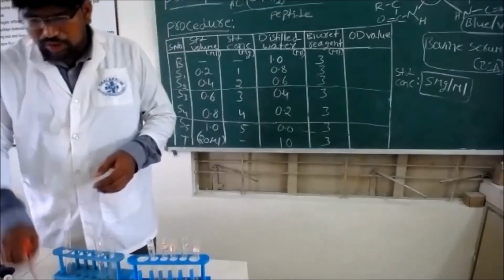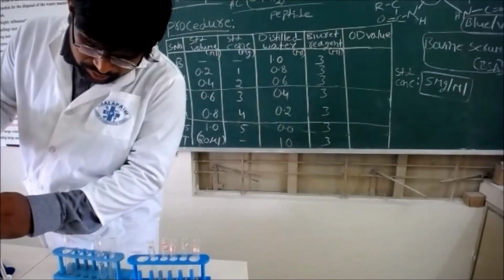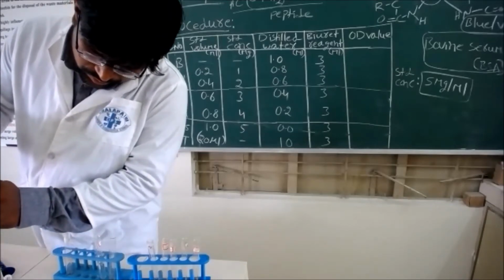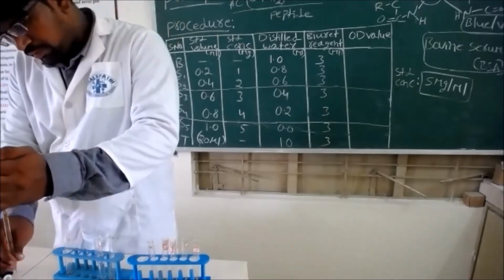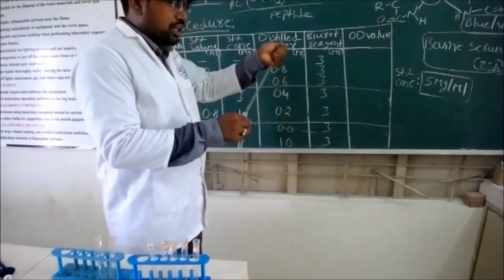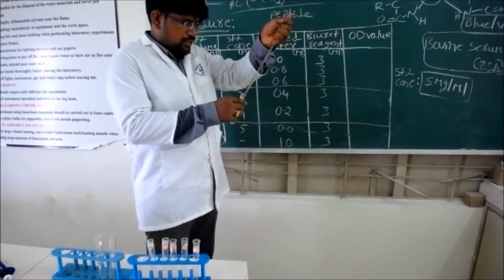Now the blank. In the blank preparation, we have to take 1 ml of the distilled water.